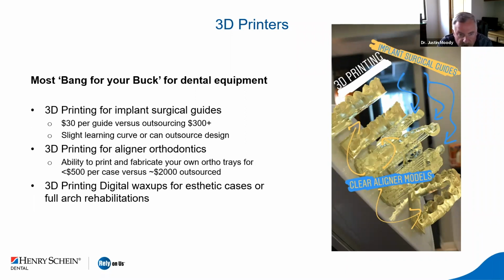3D printers for aligners and orthodontics. Talk about a way to make orthodontics affordable for the masses, because there really is very little product in this, and you can have some great outcomes, especially if you pick and choose your cases correctly.